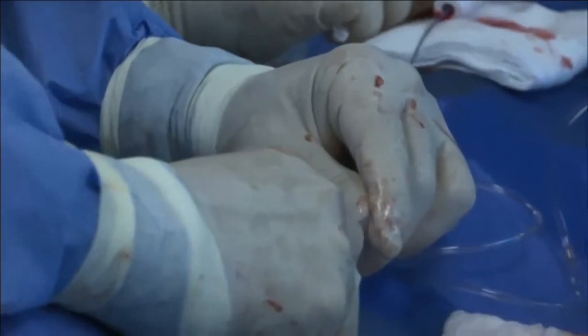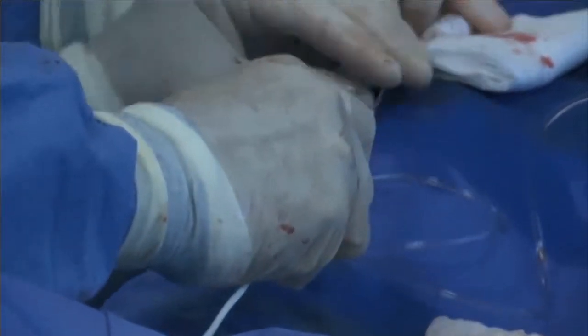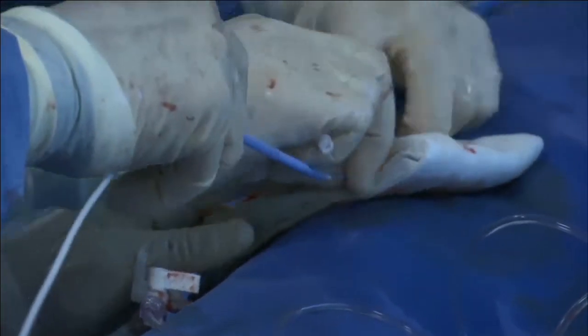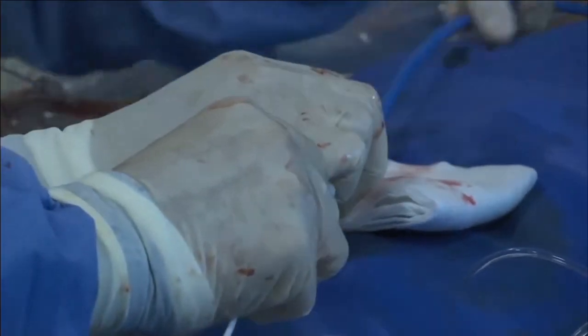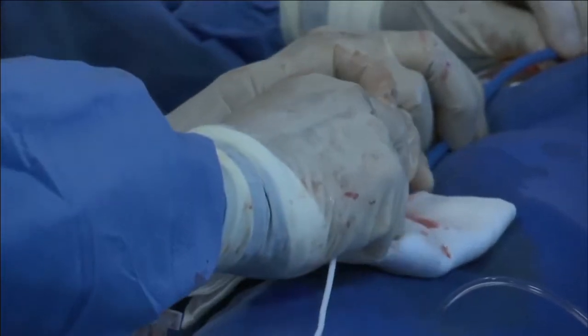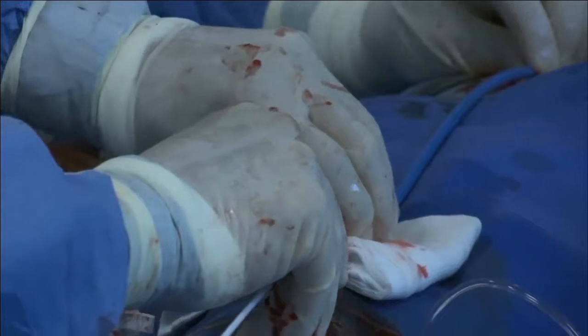So while you're doing that, I'm going to ask the audience, raise your hand if you would use a bare metal stent in this patient. I don't see any hands raised. So I'm assuming then everyone would put a covered stent in, just like what was being done, correct? Raise your hands if you would put a covered stent in. Yeah, okay, thank you. You want to see the fluoro now.